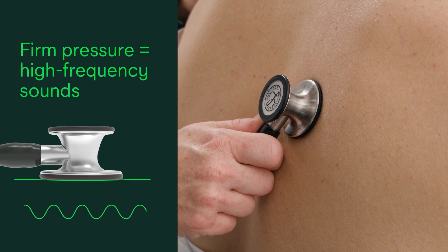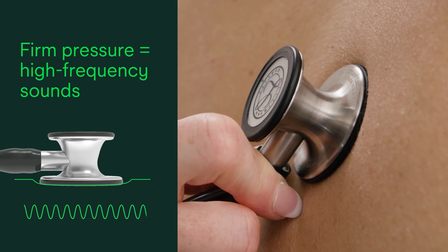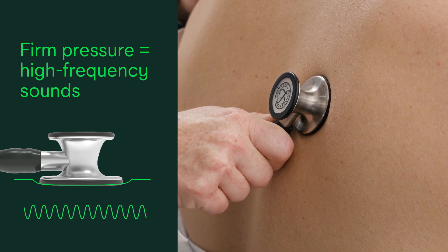To hear high frequency sounds, apply firm contact pressure to the chest piece. By pressing on the chest piece, the movement of the diaphragm membrane is restricted. This blocks or attenuates low frequency sounds, allowing you to hear higher frequency sounds.